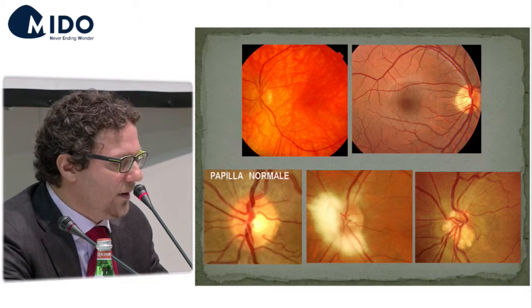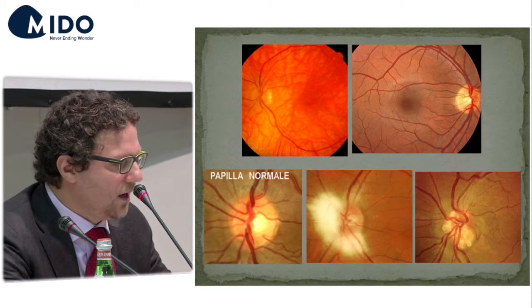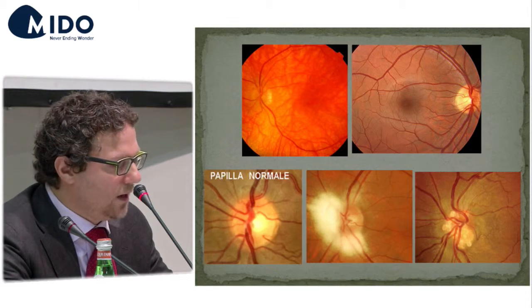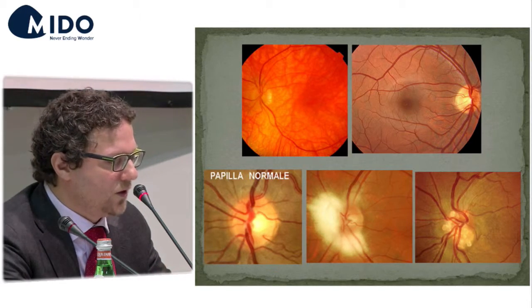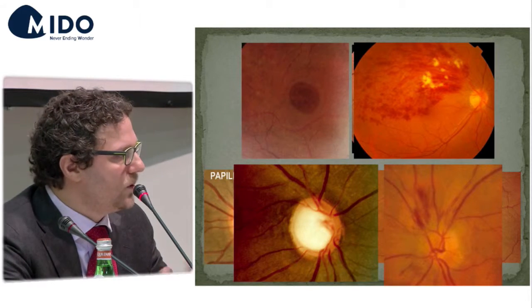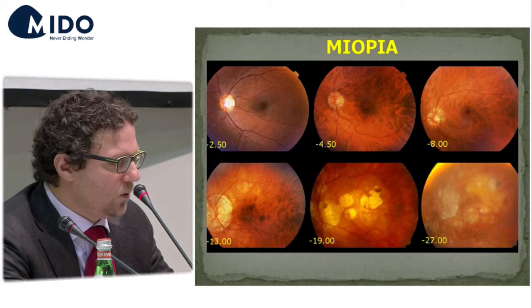This is a normal retina. In the top part, you have the normal retina of a young person without retina-related problems, and in the central part, you have myelinic fibers and drusen of the optic nerve. In case you identify complex situations, you can refer the patient to the most adequate venues.